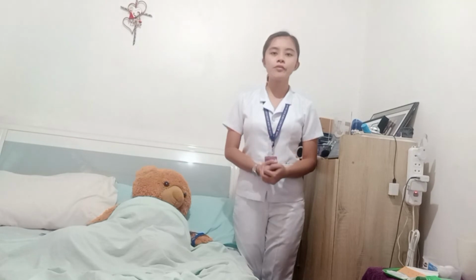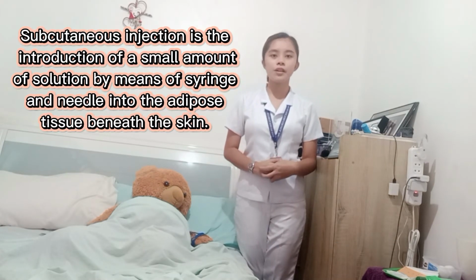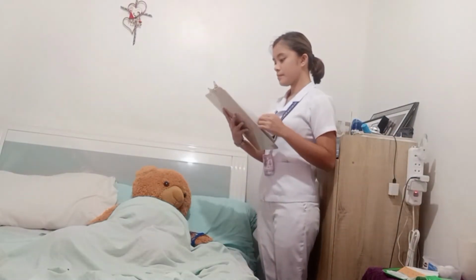So I will now perform the subcutaneous injection. Subcutaneous injection is the introduction of a small amount of solution by means of syringe and needle into the adipose tissue beneath the skin. So I will now administer the medication. So first thing to do is to check the doctor's order on the patient's chart because it is more reliable than the medication ticket.